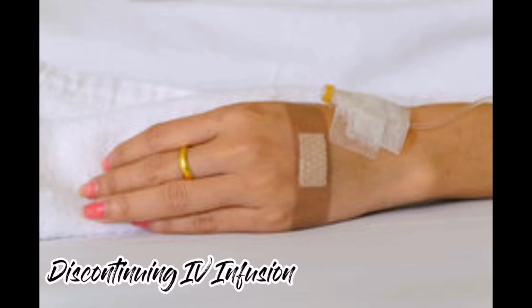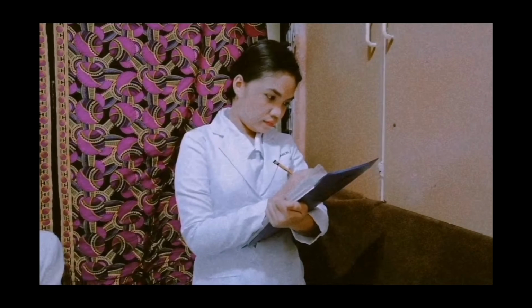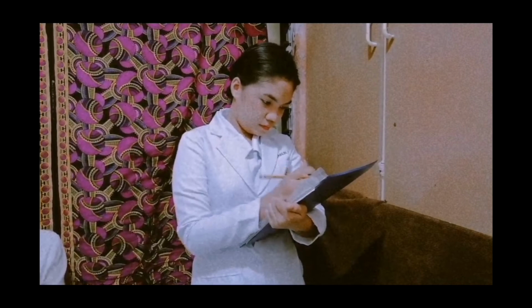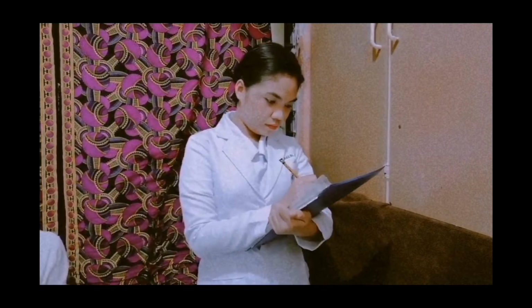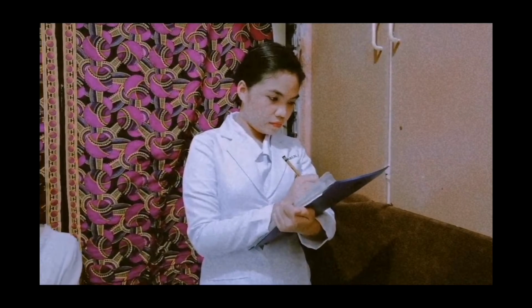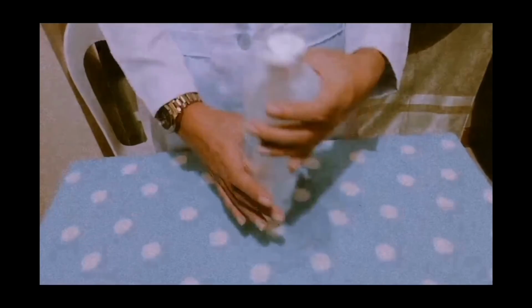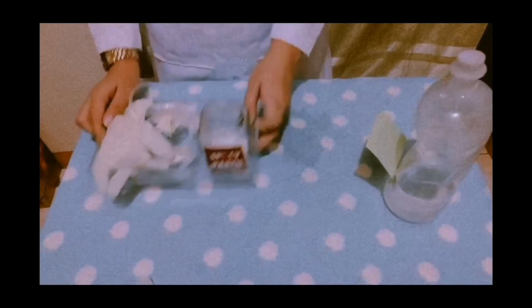And the last process is discontinuing IV infusion. So the first procedure in discontinuing IV infusion is to check the physician's order for discontinuing IV fluid. This is to prevent inadvertently discontinuing the IV and having to restart it. Second is to wash hands and assemble equipment. Having all equipment available saves time.